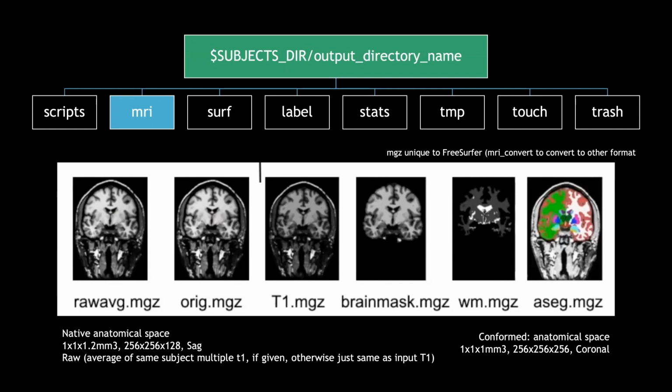The ASEG image is one of the main outputs, and it's the subcortical segmentation, the volumetric segmentation. This file will contain all the segmentations for the particular subcortical volumes: the basal ganglia, the deep nuclei, the white matter, the gray matter, etc. And this volume will also contain the segmentations of your hippocampus and your amygdala. It's an important volume, an important output.